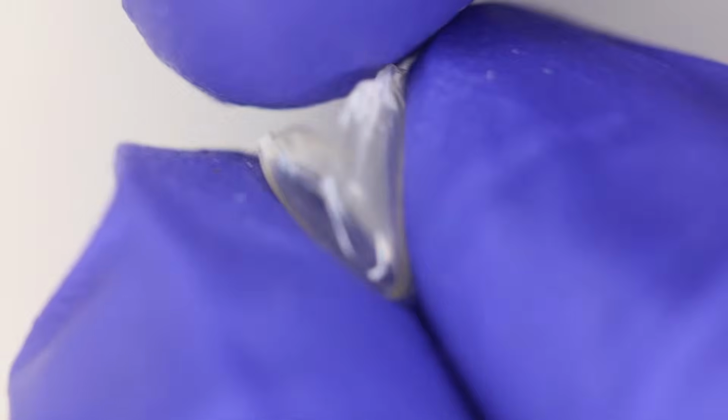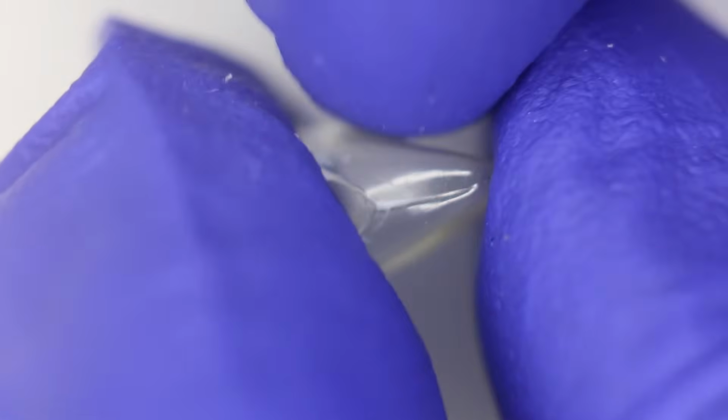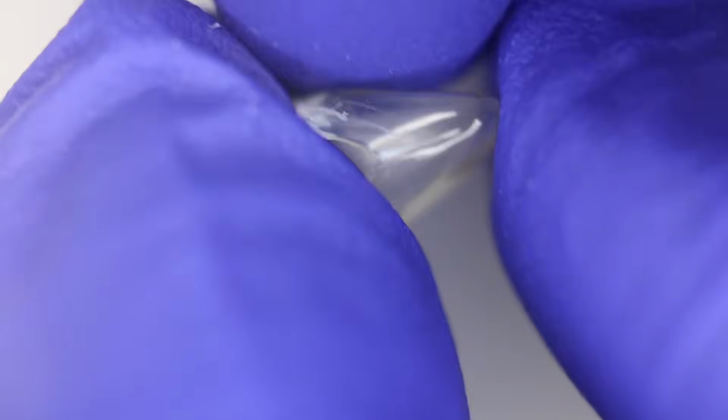Once done, just curve it up along. Finally what we get is the bulge part. You can easily identify that this is the palatal aspect and this is the buccal aspect of this crown once you cut it. Now you can test it on the tooth itself.